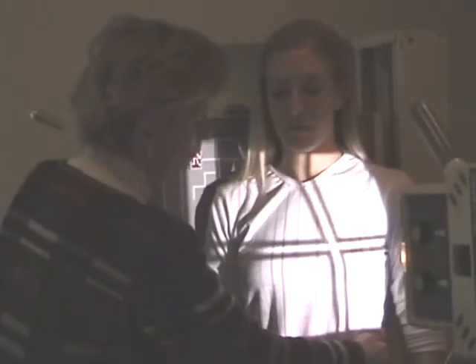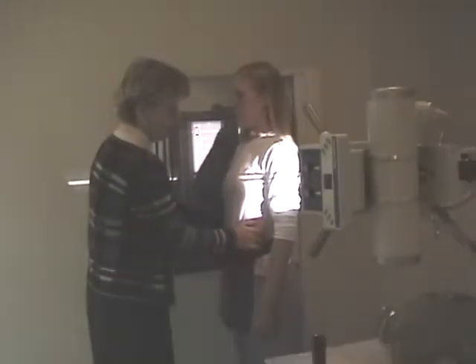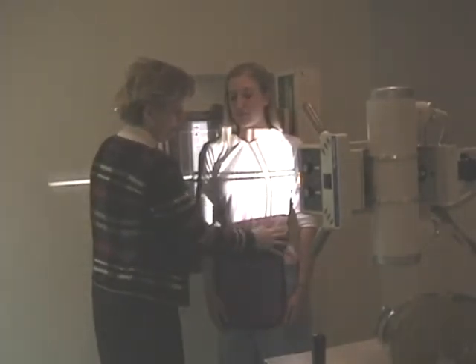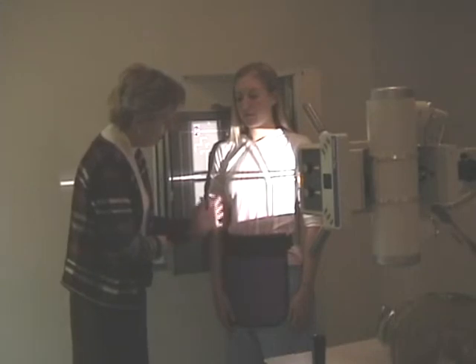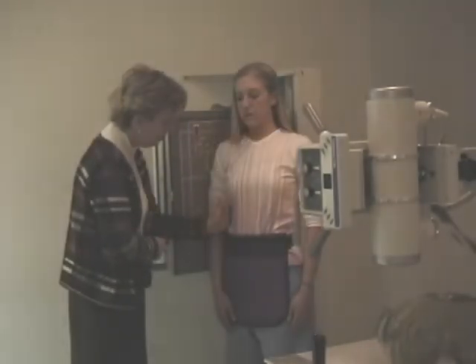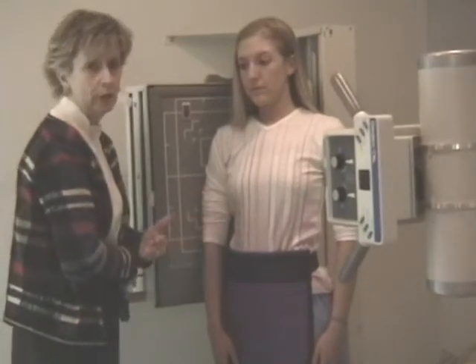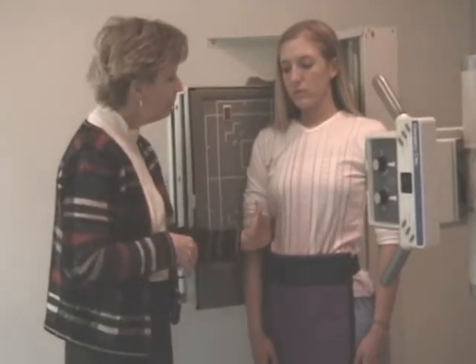So we're going to demonstrate the patient. You want her in a 45-degree oblique. This would be 90 degrees. Take her back halfway or bring her out halfway from the film, but 45 degrees. The purpose of the oblique is to lay out the lateral ribs. Okay? Some patients might need a 50-degree oblique. Some patients might be okay with a 40-degree oblique. You've got to think about the purpose of this position, and it is to lay out the lateral ribs.